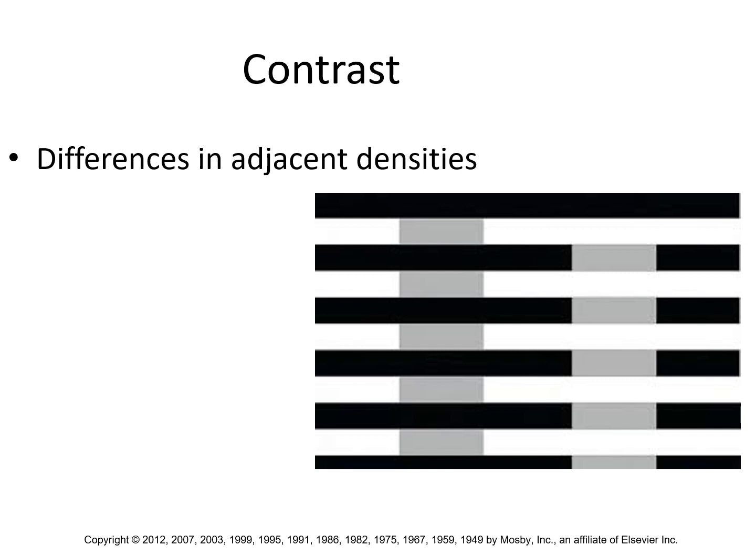The contrast that we see is relative to its environment. It's relative to its surroundings. The reason that you think the left rectangles are a darker shade of gray is because they're surrounded by white to the left and to the right.